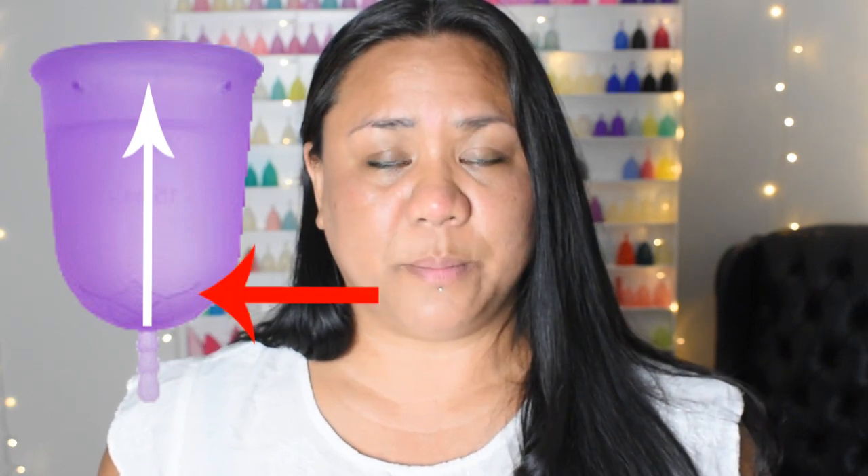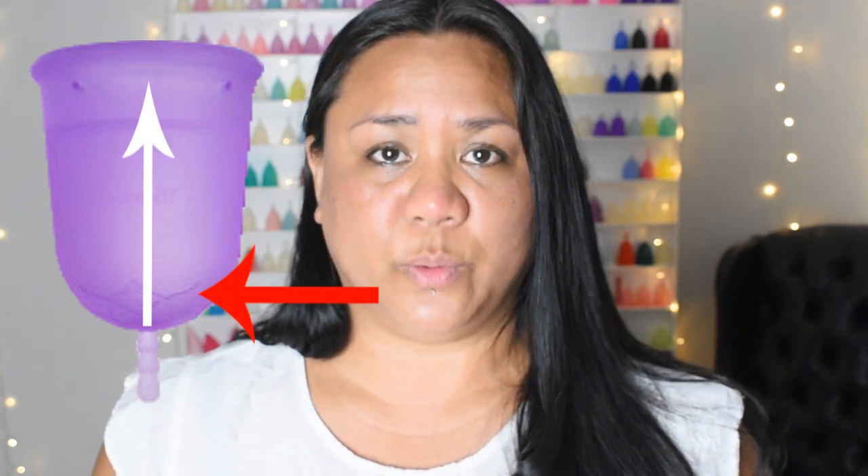I didn't get a really strong seal when using the Venus Cup but I did have some resistance when I gave the base a gentle tug. Because it has an elongated body it was easy for me to reach the base of the cup, give it a pinch, break that seal, and remove it without suction. Please remember that we might have a different experience in how tight of a seal is created — I know that some cups that don't create a very tight seal for me create a tight one for someone else, or vice versa.